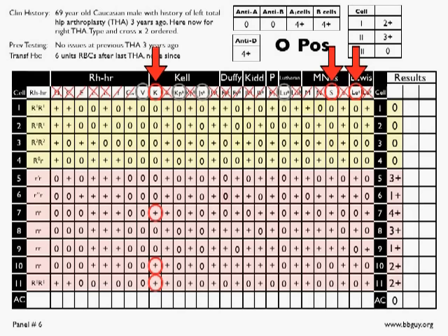Anti-big K doesn't work by itself for obvious reasons. Anti-big S doesn't work by itself for obvious reasons. And anti-Lewis a doesn't work by itself for obvious reasons. And honestly, it would be uncommon for anti-Lewis a to be reacting in gel or solid phase at this point. But it's possible. So obviously, we don't have any match.